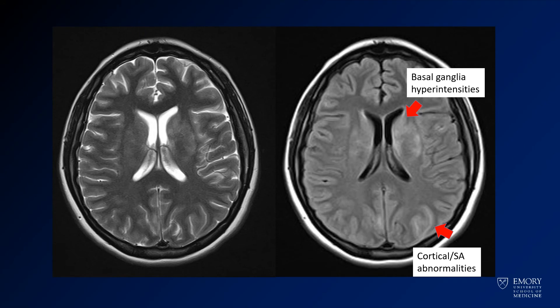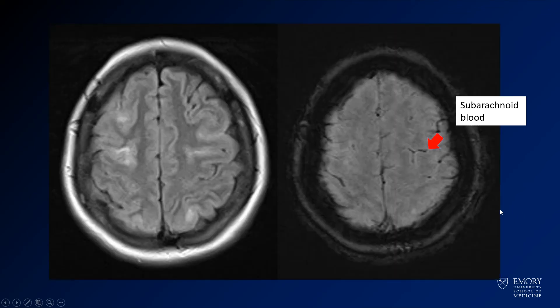Here you'll see that there are some basal ganglia hyperintensities on both T2 and FLAIR, and then you have cortical signal abnormalities following this whole side. As you get a little higher, you have some cortical signal abnormalities on both sides, and you see there's some abnormal susceptibility in the sulci — that's a little bit of subarachnoid blood associated with this.